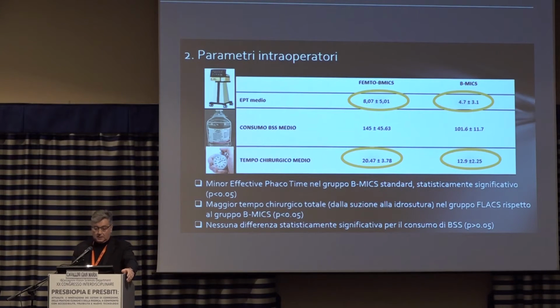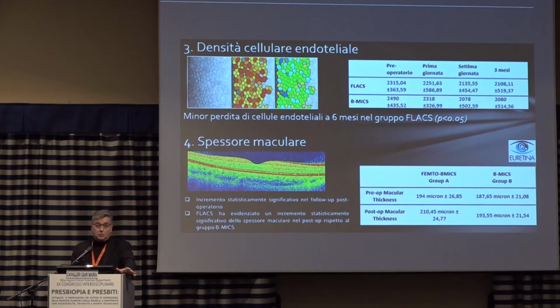However, I'm still in the training phase because I've been using it for just a few months, and I'm learning and I'm speeding up. I have less endothelial cell loss with femto laser techniques, and macular thickness is also very important.